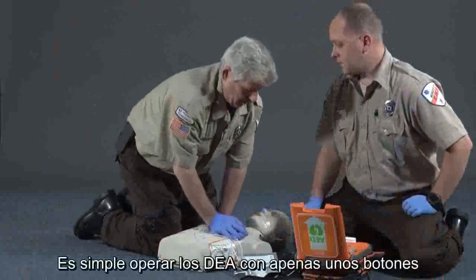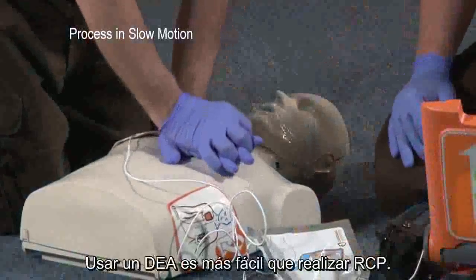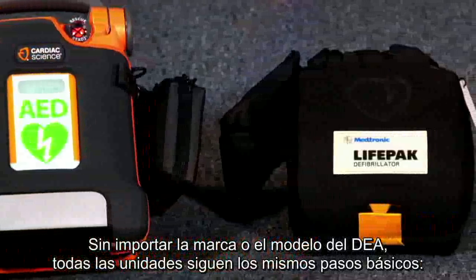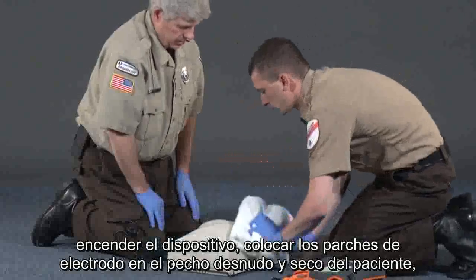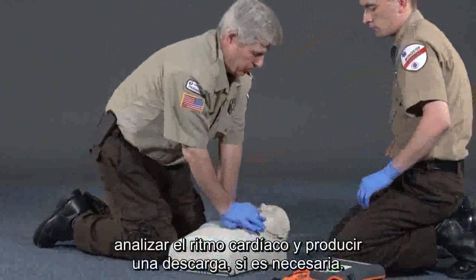AEDs are simple to operate. With only a few buttons and voice prompts as a guide, using an AED is easier than giving CPR. Regardless of the AED make or model, all units follow the same basic steps. Turn the device on. Apply electrode pads to the patient's bare, dry chest. Analyze the heart rhythm and deliver a shock if needed.